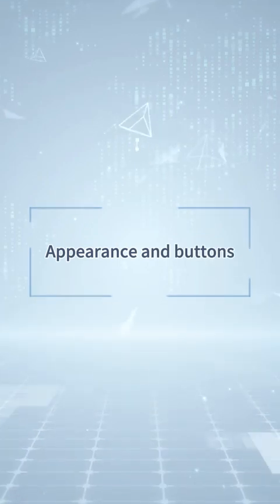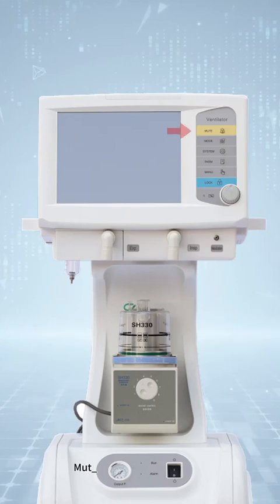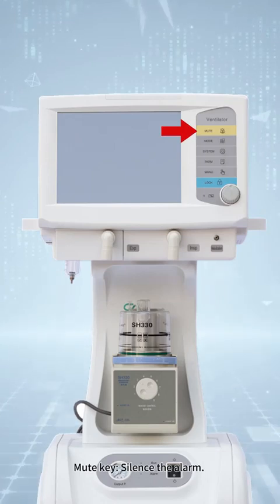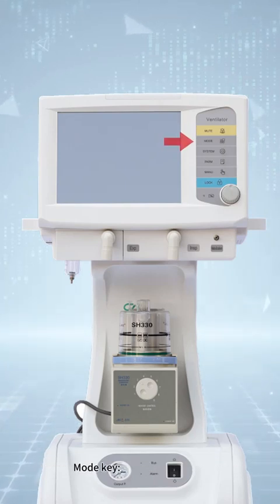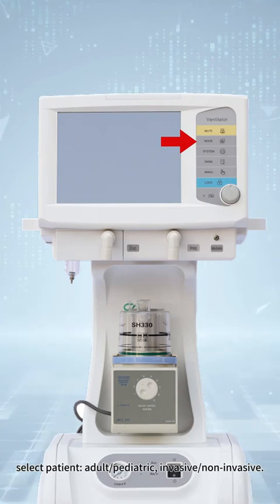Appearance and buttons. Mute key, silence the alarm. A 120 seconds countdown will appear on the screen. Mode key: in standby mode, select patient adult or pediatric, invasive or non-invasive.